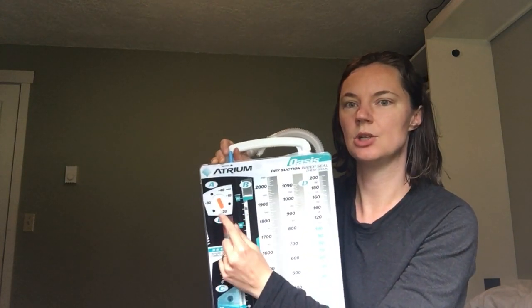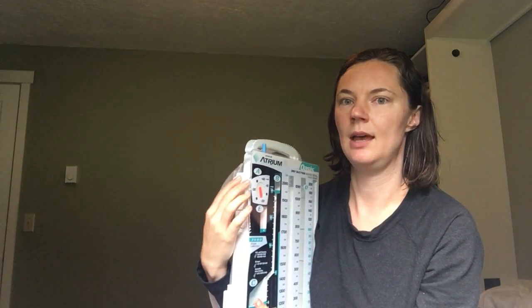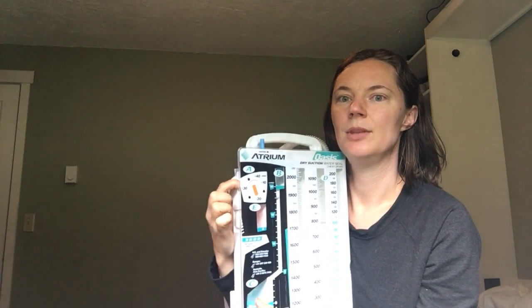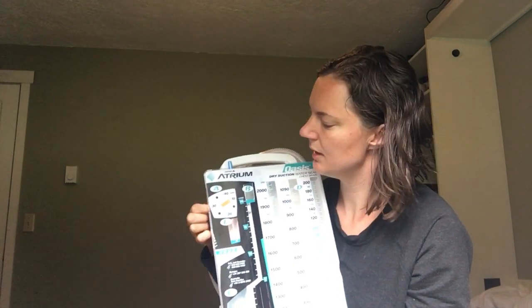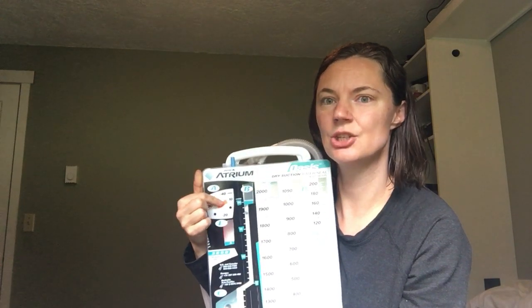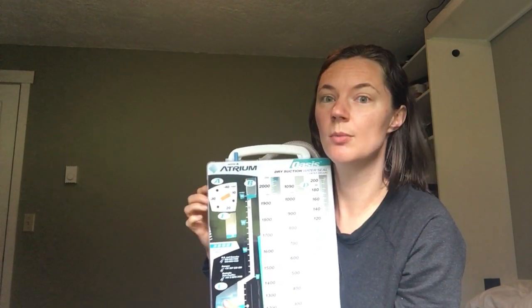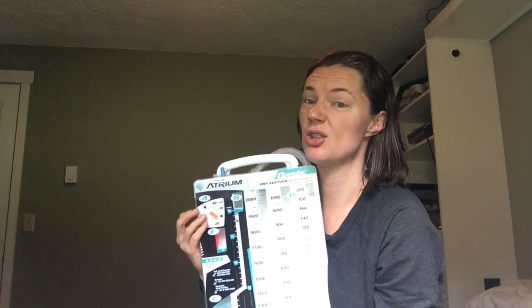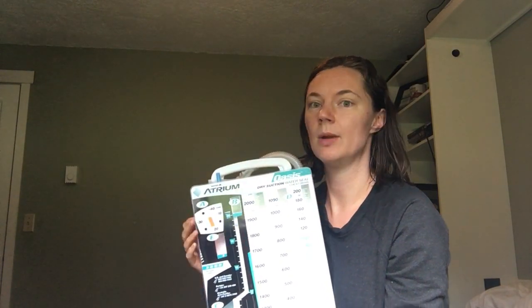But on this one, the suction is based on this dial here. There's a knob right here on the side. There it is. That you can turn to adjust the suction to the number. So this is a -10 suction. Or -20 suctions are the two most normal ones. Check your orders to see what they say and make sure your suction is turned to what the order says for the -20 or the -10.